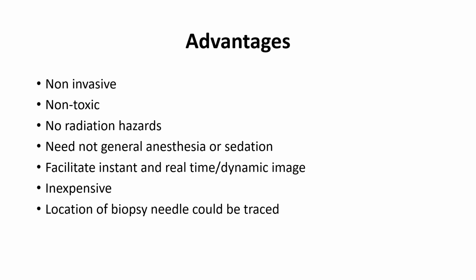So now we come to the benefits or the advantages of ultrasonography, especially reproductive ultrasonography. It is non-invasive. There is no surgery involved in it. It is non-toxic, has no radiation hazards, and needs no general anesthesia or sedation. It facilitates instant and real-time dynamic images. You can see the live images of the objects. It is mostly inexpensive compared to other techniques, and you can see the location of the biopsy needle in this.